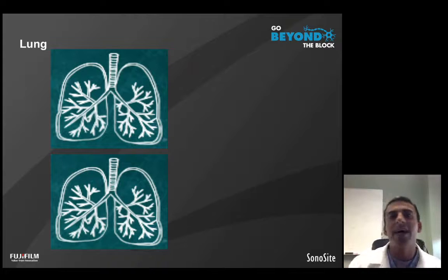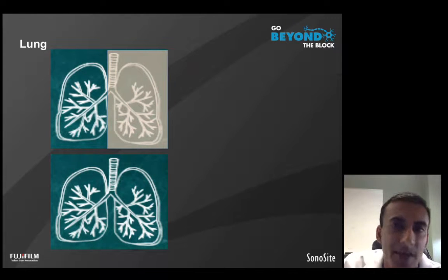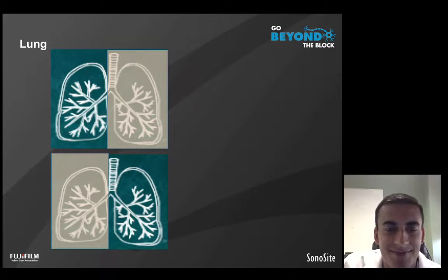And let me try to highlight an example of that. Here is a recorded audio of an auscultation exam of a patient's breath sounds after receiving an endotracheal intubation. Here's the patient's left side. And here's the right.